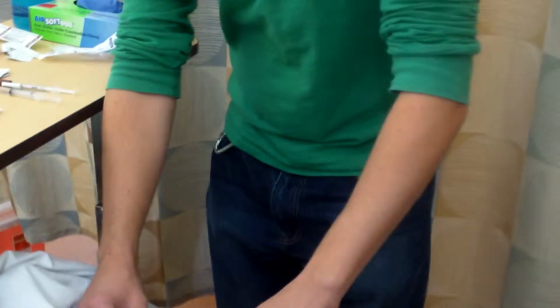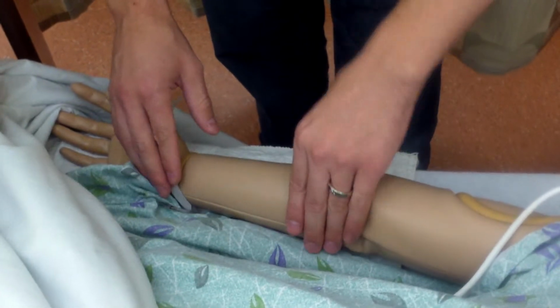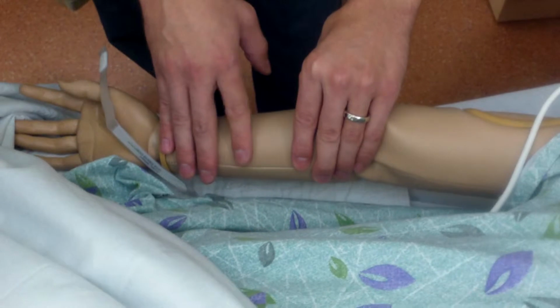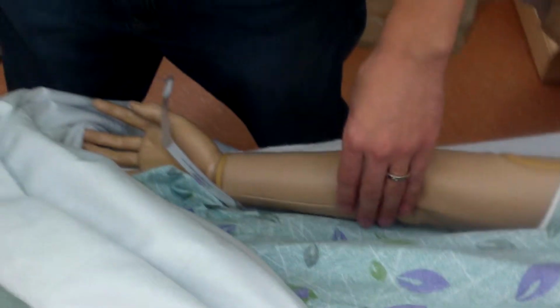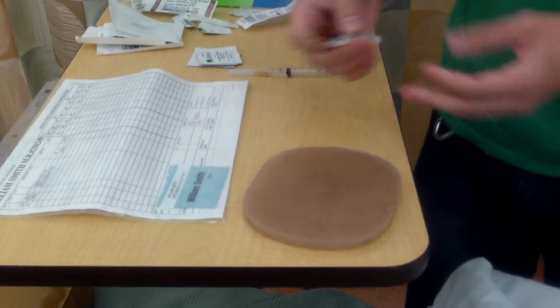So the first thing I'm going to do is find the anterior portion of the arm. You see that? Okay. So I'm going to do 4 fingers from the elbow joint, and I'm going to find right in the anterior portion, right about there. And for the purpose of this video, I need a specialized pad. So I would generally place this over there, but for better positioning, I'll demonstrate that. So then I have my intradermal.